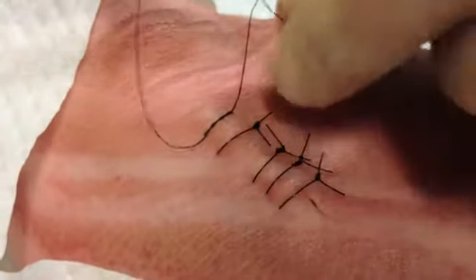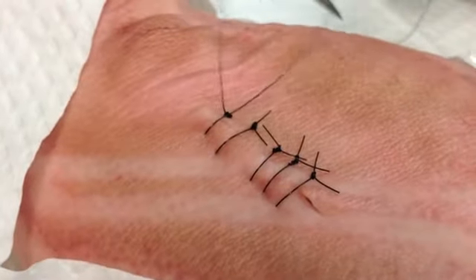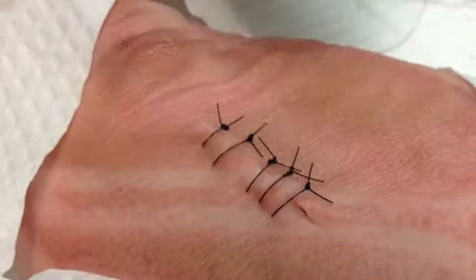What you might end up doing instead is getting an inverted wound, which is going to cast some funny shadows and leave a more prominent scar at the end of the day. Also, as you see, the way this suture ends up sitting is a little bit different than the adjacent sutures, and that's simply because the bite was too shallow.